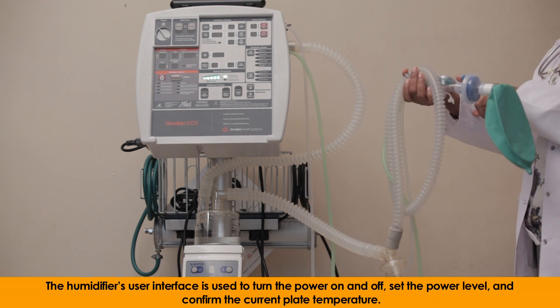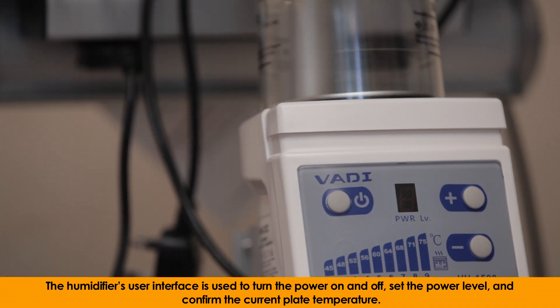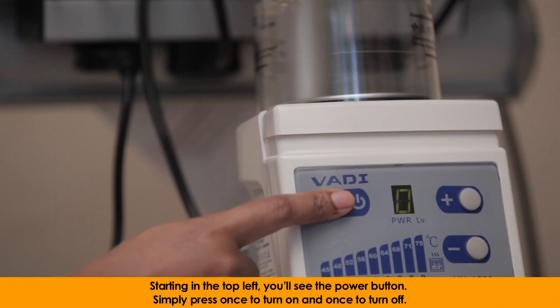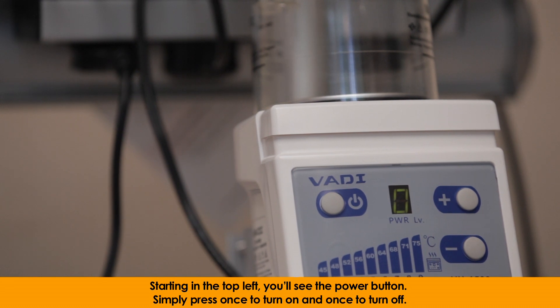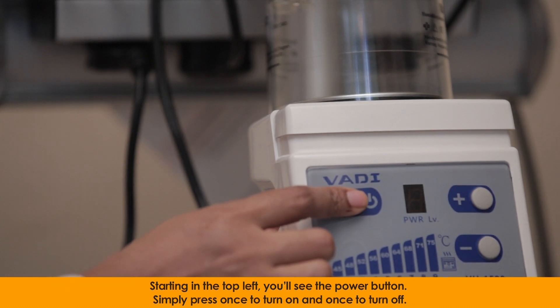The humidifier's user interface is used to turn the power on and off, set the power level, and confirm the current plate temperature. Starting in the top left, you'll see the power button. Simply press once to turn on and once to turn off.